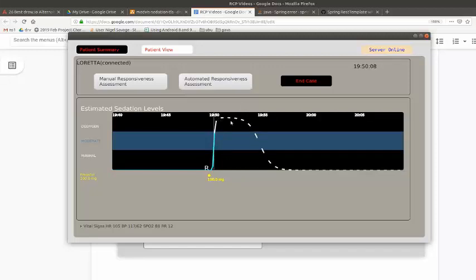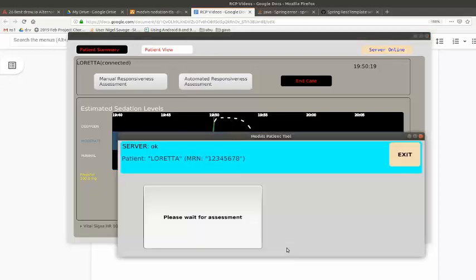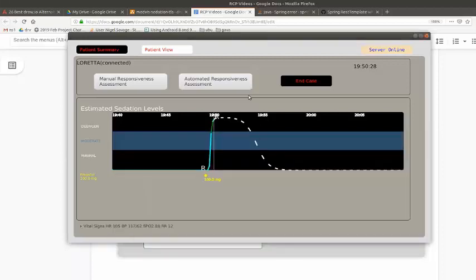Up here, this is around the 90 to 95% range, so the patient is already most likely unconscious and ready for the operation. We could check that, because we don't want to be operating on people that aren't unconscious, no matter what our scientific modelling tells us. So we perform another assessment. This happens at the patient, and there's the response. So the patient is not really unconscious.